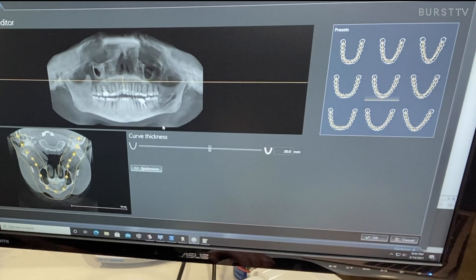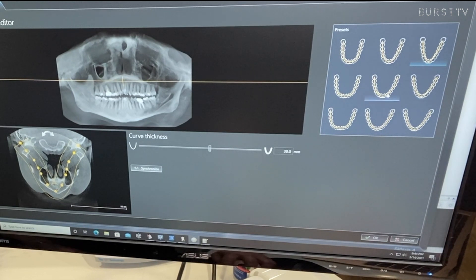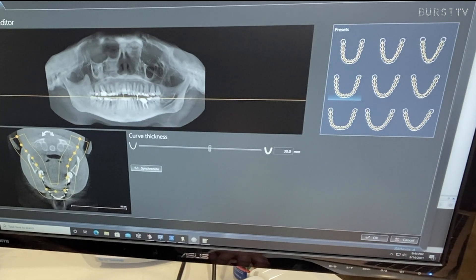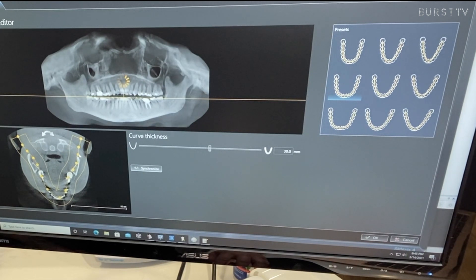Another thing I love about this technology is if you take an x-ray and it's not the greatest — you can see it's just not as thick here as you'd like — you have the ability to change what that looks like. We have some presets on the side; we can just fix it and see if any make it look better. When we bring the line down to the center, right above the mandibular teeth, I can also manipulate it on the bottom to where I can actually follow the patient's jaw and make it look correct on the screen. You can see how it's filled in more on that side, the bone looks even on each side, and you can have it synchronized on each side. It gives us the ability to do a lot more than a typical panoramic would do.